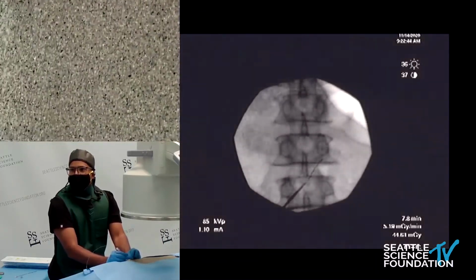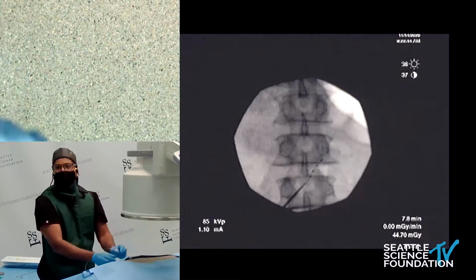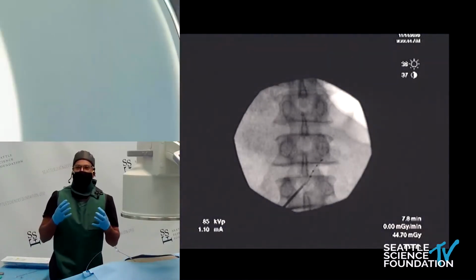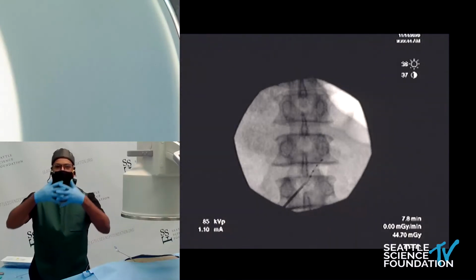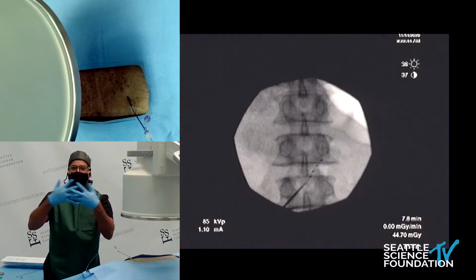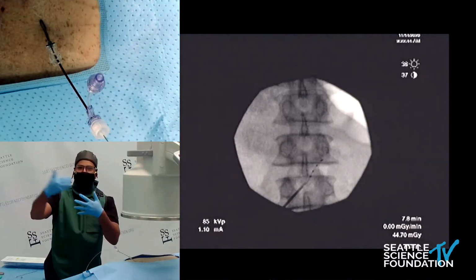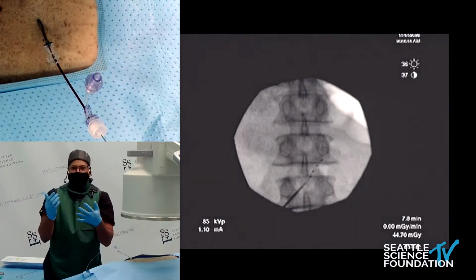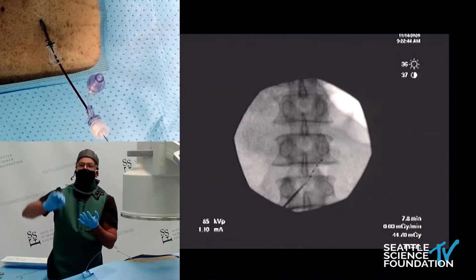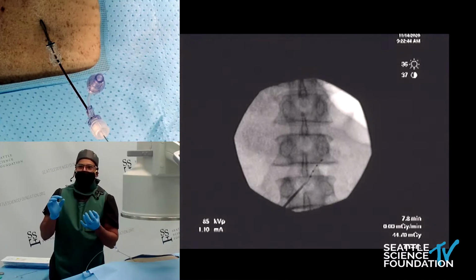Perfect. And now, guys, I'm at this point here that I can feel, you can't really see, but I can feel the tension right here. And what this is are the neuroforaminal ligaments, okay? This is exactly what you feel when you're doing your transforaminals from the outside in, and you feel that pop or that loss of resistance with your Quincke. Now I'm trying to push out, and I'm pushing out with a larger diameter sheath.